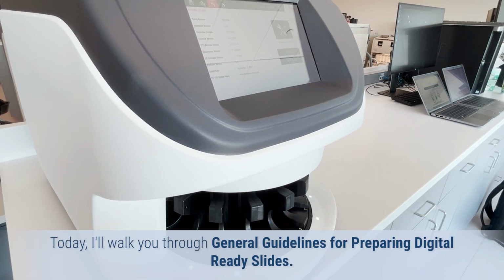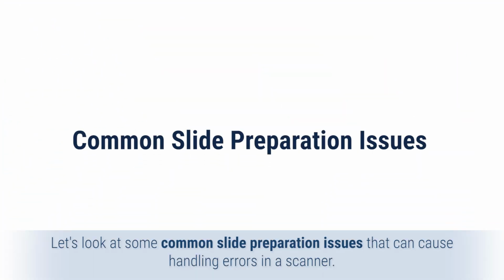Today, I'll walk you through general guidelines for preparing digital-ready slides. Let's look at some common slide preparation issues that can cause handling errors in a scanner.